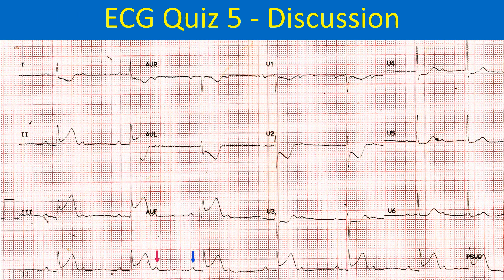The PP interval is half that of the RR interval. The P wave marked by the red arrow is non-conducted, while the P wave marked by the blue arrow is followed by a QRS complex. So it is a 2:1 AV conduction — the highest grade of second degree AV block.